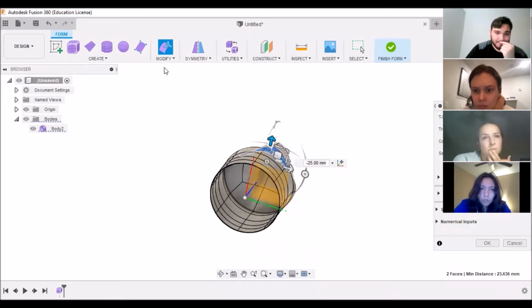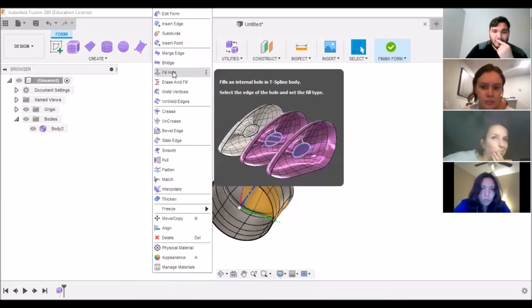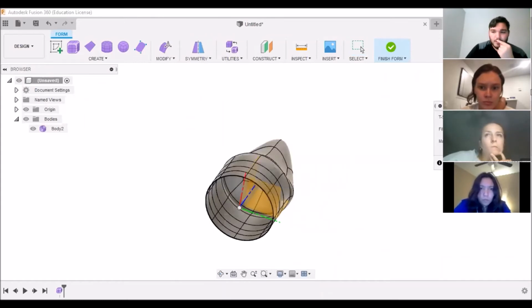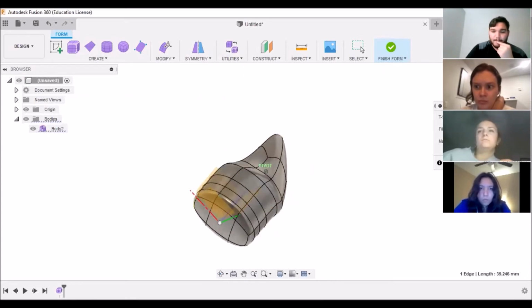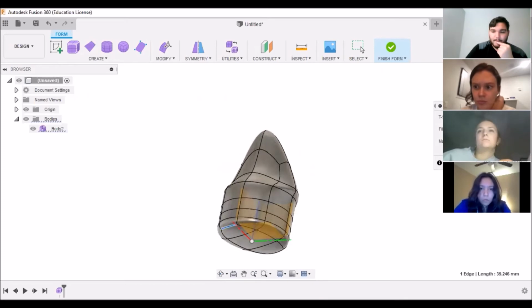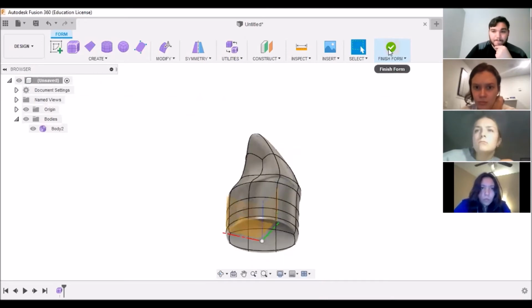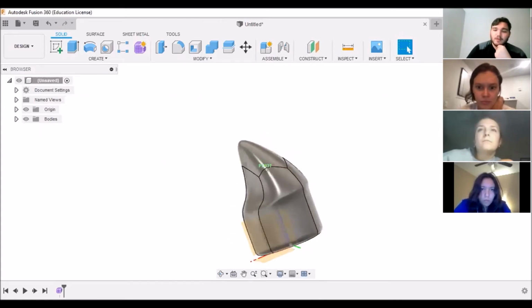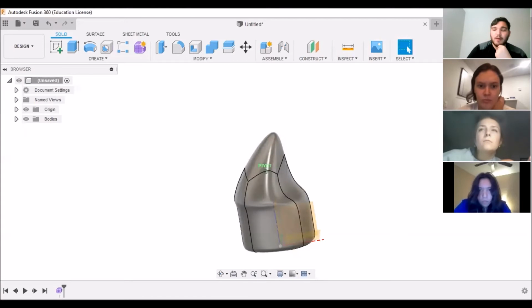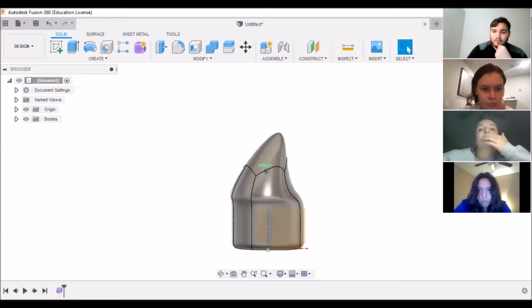So in order to fix that, let's see. Cancel. We can modify, fill hole, select your edge, and then it fills that hole for you. And once you're done, you can press OK. And then finish form. And then now it looks exactly like a body that we were working with earlier. Does that make sense?